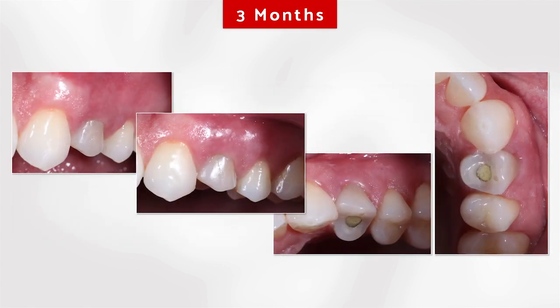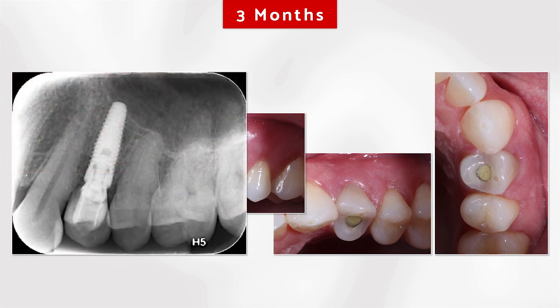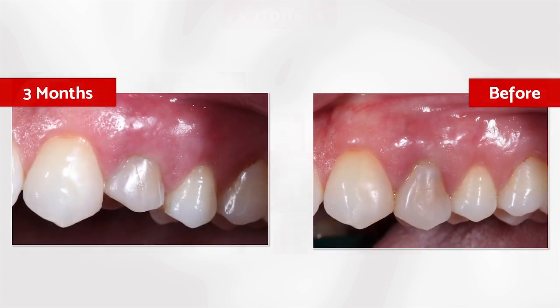3 months after this procedure, here you can see the soft tissue is completely healed and the bone tissue is healed as well. We have the bone repair finished all around the implant. So it's time to take the impression and to make the final restoration.